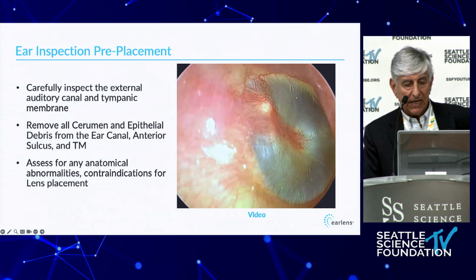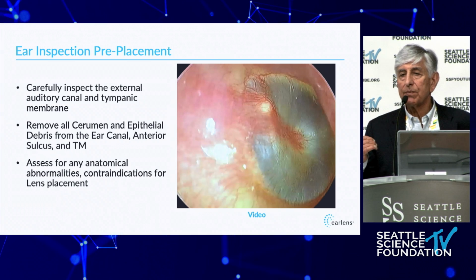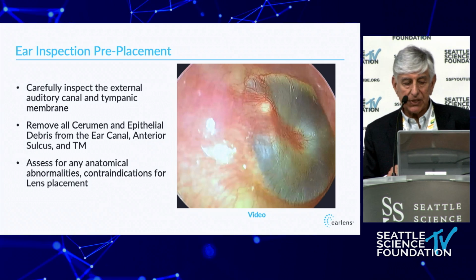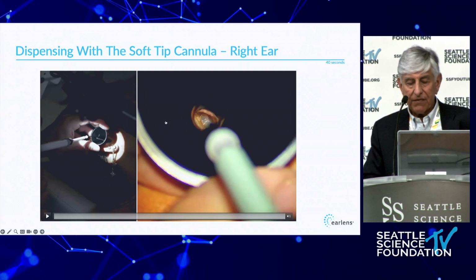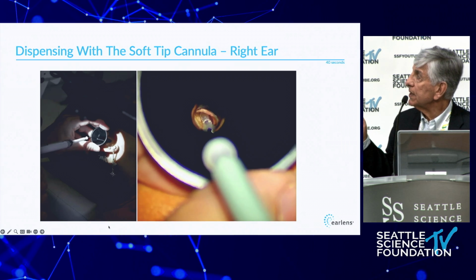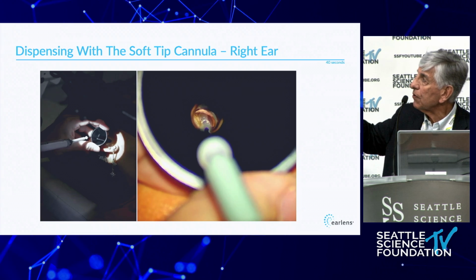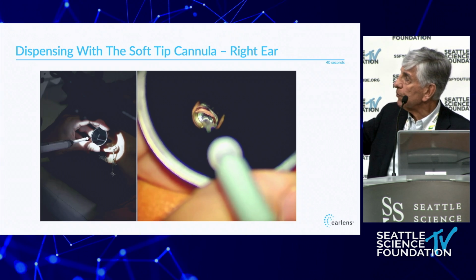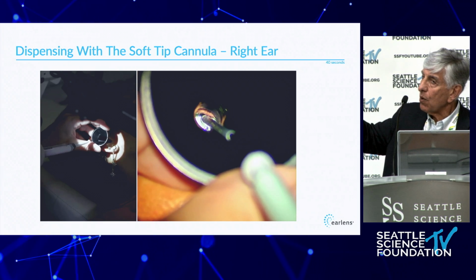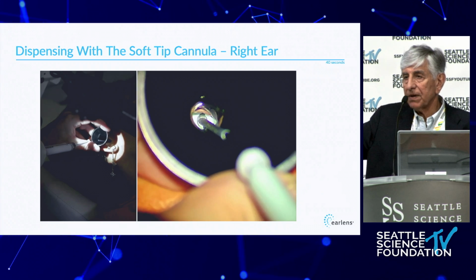First of all, you have to clean the ear, and there are some ears that you want to put it in, but you simply can't because the ear canal is too narrow or there's too much of a mastoid hump. You have to be able to visualize the entirety of the tympanic membrane, at least 70% of it. After we visualize that, we have to make a mold. The hearing aid industry does this all the time, but they don't go all the way down to the eardrum. Through a speculum, we inject this material that gives me the shape of the medial ear canal wall and tympanic membrane, because you need that measurement before you can fit the lens to each and every patient.